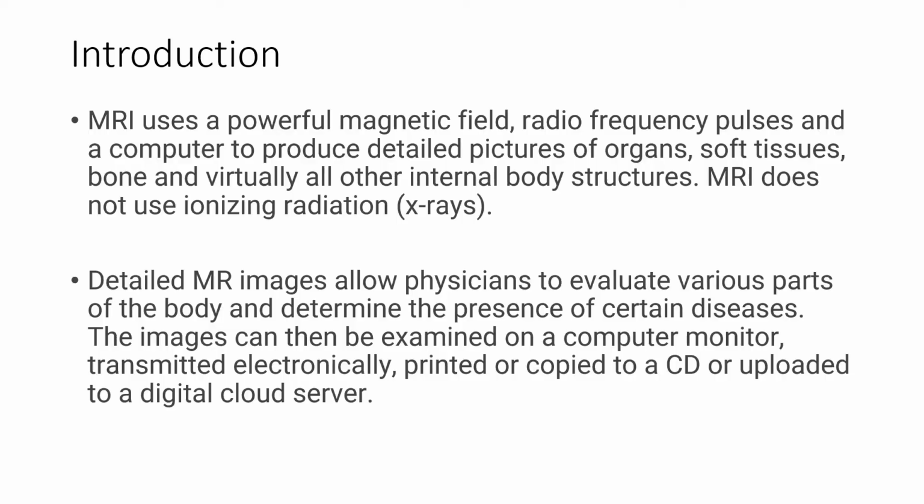In other words, it is the use of a powerful magnetic field around the bore, and the use of radio frequency pulses or the echoes themselves, to realign the hydrogen atoms in the human body to produce an image. It can be seen on a monitor, with detailed organs or soft tissue, the bone, as well as other internal structures. The examination will not involve ionizing radiation or X-rays.